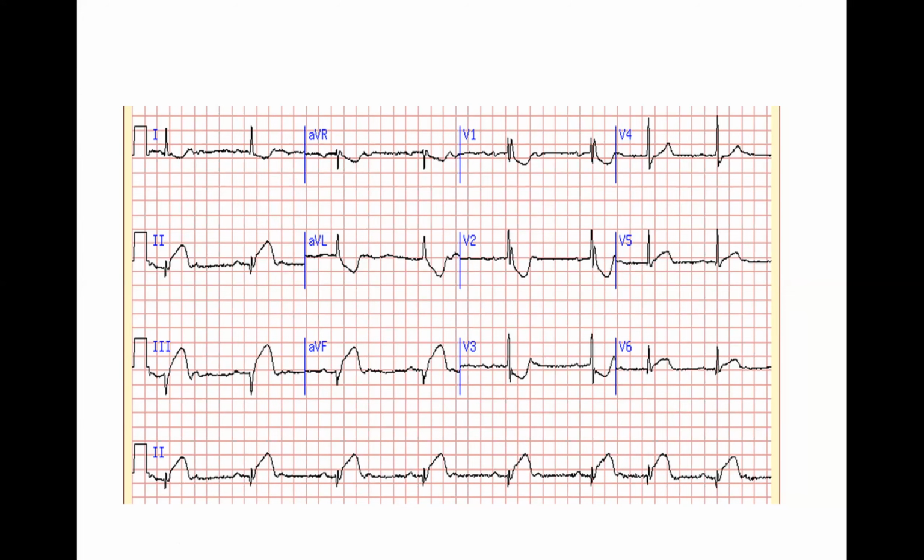We said, guys, avoid overcalling. Avoid overcalling. Okay, if this is a spike here, where is the spike here? Would this QRS be a paced rhythm? It is narrow. Okay, that breaks the rule. There is no pacemaker spike. This is a narrow native QRS. So there is no pacemaker.